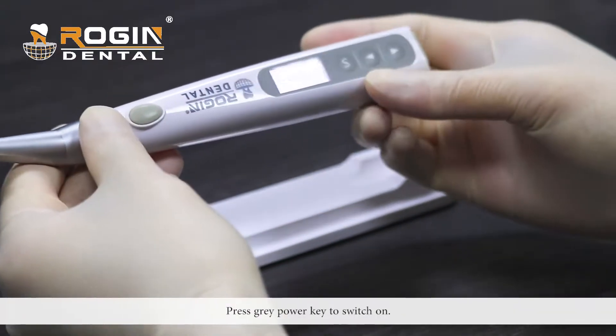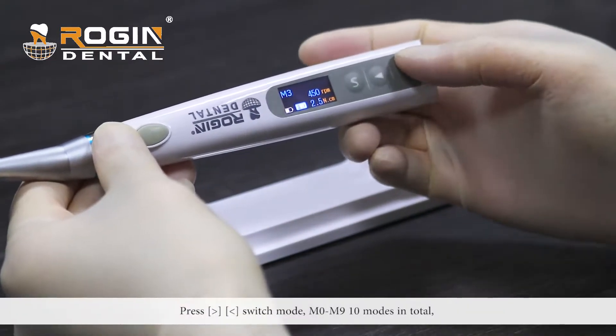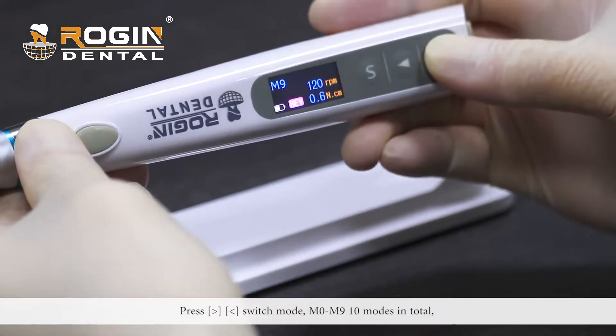Press the gray power key to switch on. Press left or right to switch mode. There are M0 to M9, 10 modes in total.